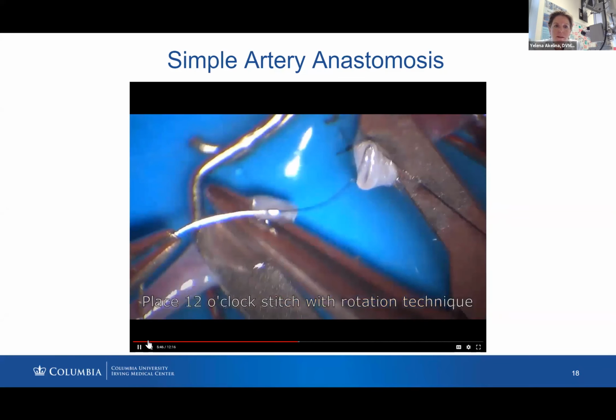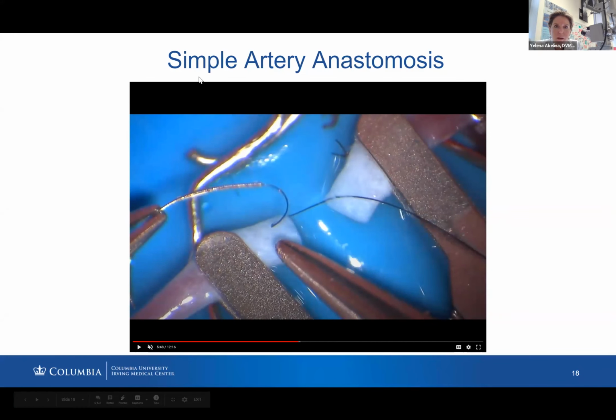So somebody is raising a hand, let me stop for a second and see what question they are asking. Scissors are kept parallel to cut the end of the vessel. Is it possible during the last suture? Possible what? Yes, you can keep the scissors parallel to cut the end of the vessel. And I don't understand what's possible during the last suture. Ray, state more clearly what exactly the question is. So let me move on.